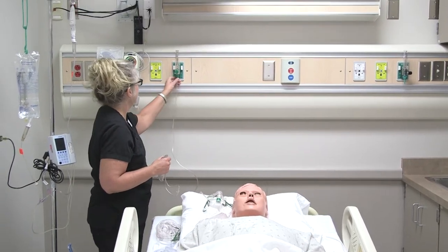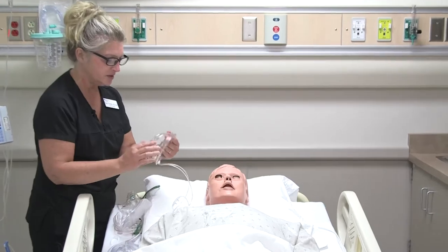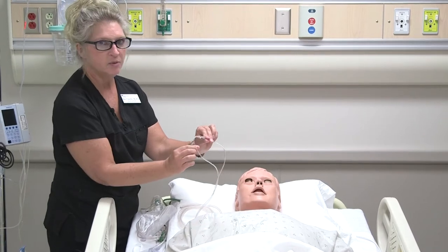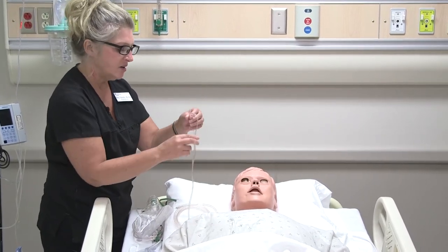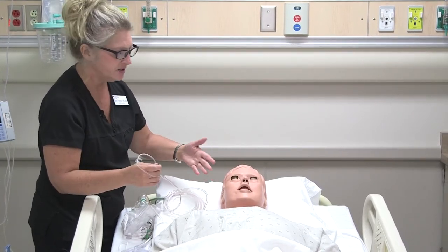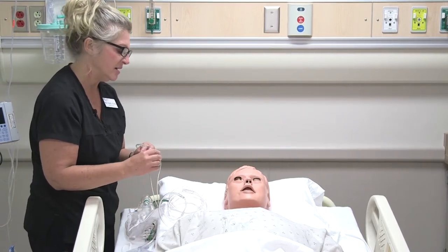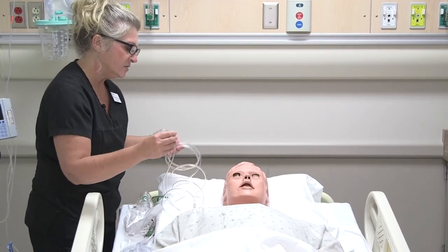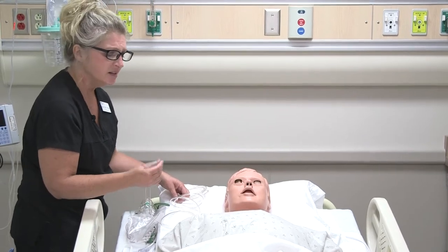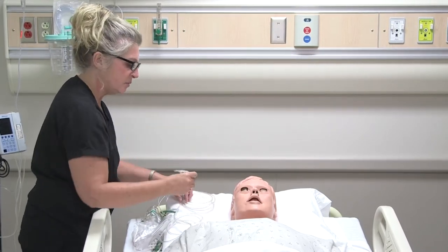For this first one, I'm going to demonstrate a simple nasal cannula. Nasal cannula is considered a low flow delivery system. You can see that it has two prongs, and those two prongs will go into the patient's nostrils. Just make sure when this is ordered that you assess your patient first — assess the respiratory status, make sure you've got their pulse oximetry on so you can monitor their oxygen levels. Also make sure it's appropriate for them. If patients are mouth breathers, this isn't really going to help because you have to breathe through your nose to get the oxygen, so just make sure it's an appropriate type.